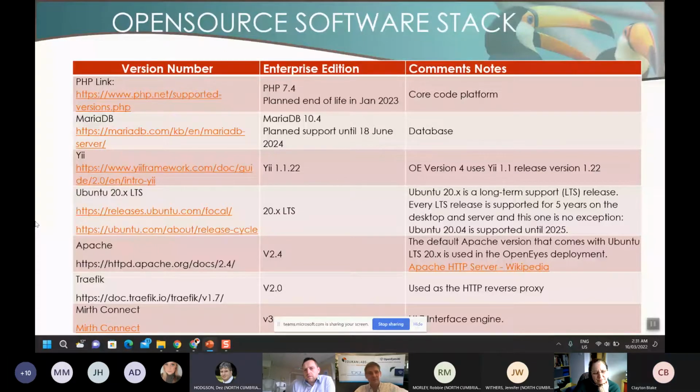We're desperately trying to get off Internet Explorer 11. I think all of our machines have Chrome on at the moment, but we're going to shift to Edge. So the new version of Edge, is that acceptable? We haven't done extensive testing with Edge, but a lot of people use it. It's HTML5 compliant, so it works with any HTML5 compliant browser.